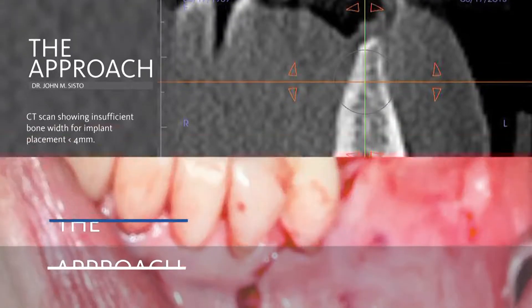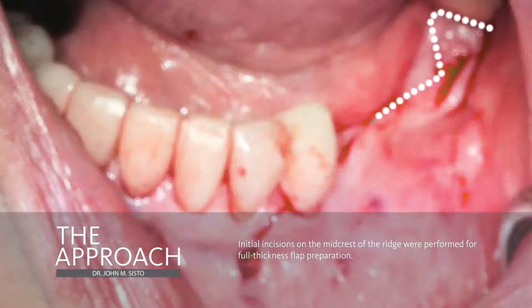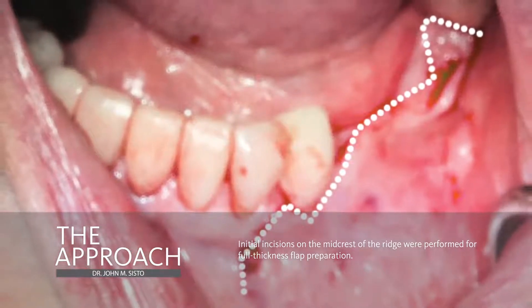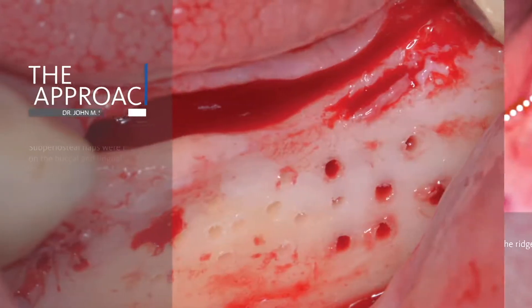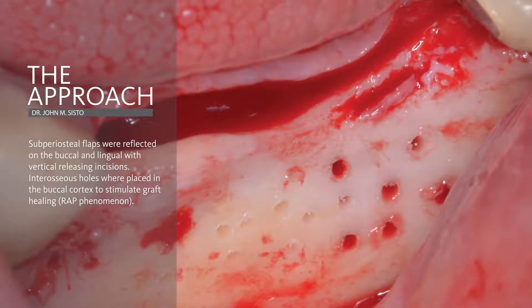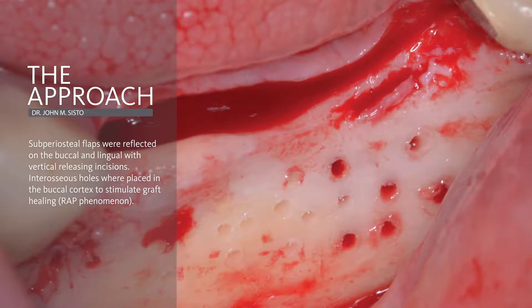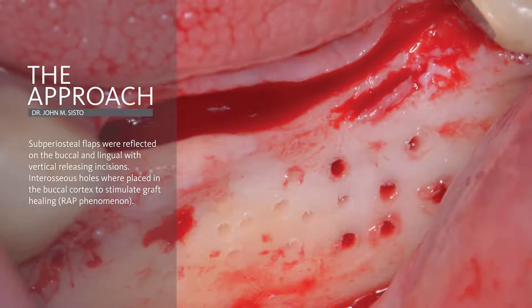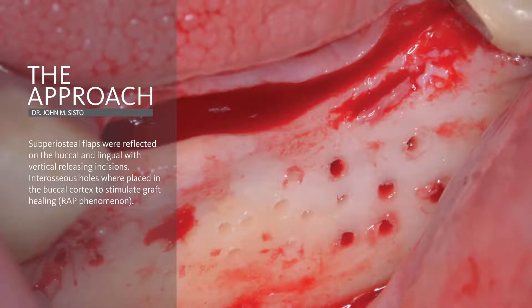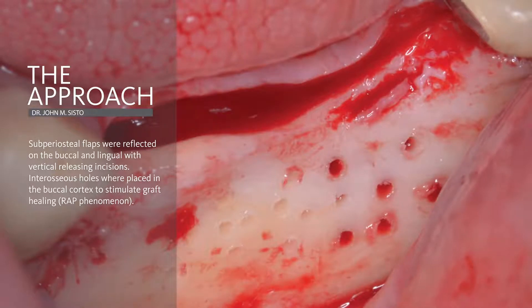An incision was made mid-crestal over the edentulous area. Dissection was then carried out in a subperiosteal plane until the ridge was fully exposed on both the buccal and the lingual surface. Scoring of the periosteum was performed on both the buccal and lingual flaps. Next, utilizing a 1.2 millimeter burr, interosseous holes were placed on the buccal surface in the edentulous area to expose the underlying marrow.